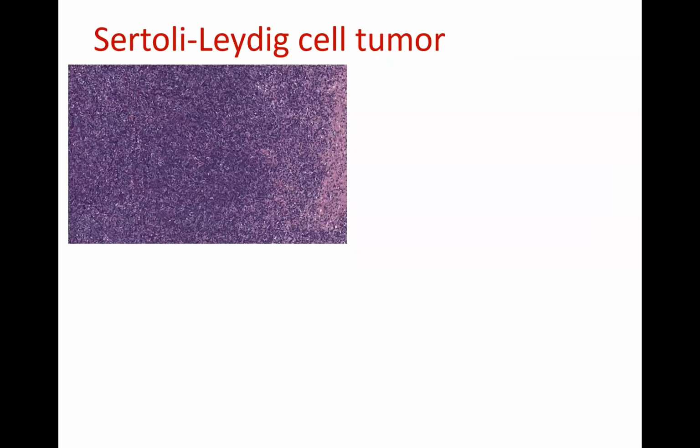All right. Let us move to the next category, the male differentiation. And I'm presenting you with a very cellular blue tumor, lots of cells, lots of proliferation. What is going on in your head now? Is it sex cord-stromal or is it carcinoma? I think we can get that. It is not carcinoma. So get out of that highway. Now you are in the other highway. So is it thecoma? Or is it sex cord, i.e. Sertoli? That should be your question.